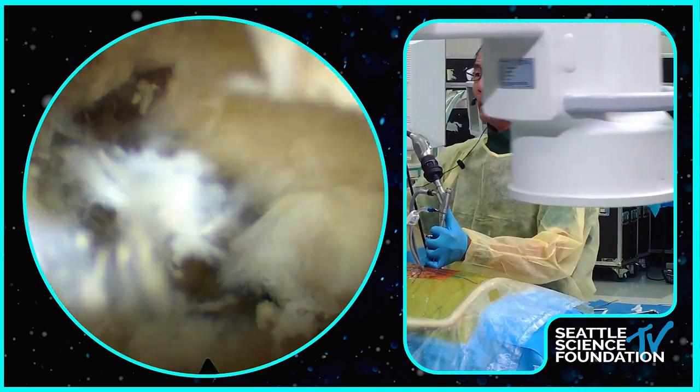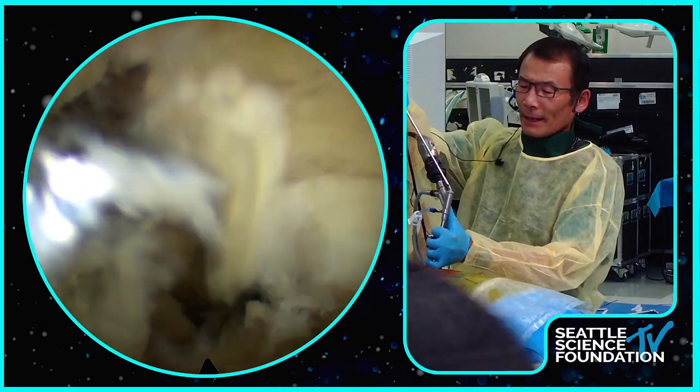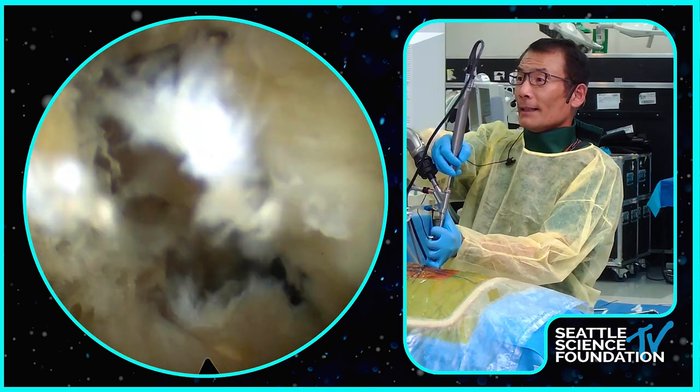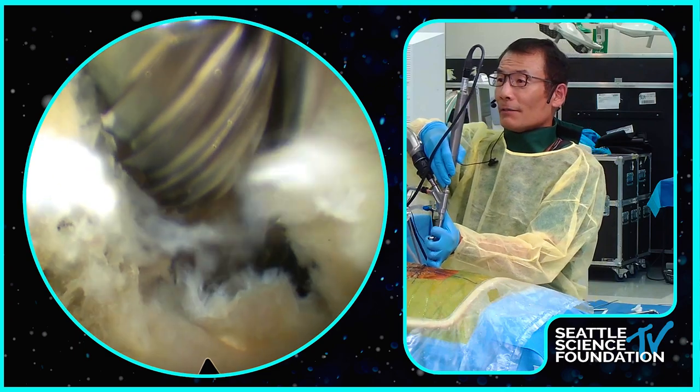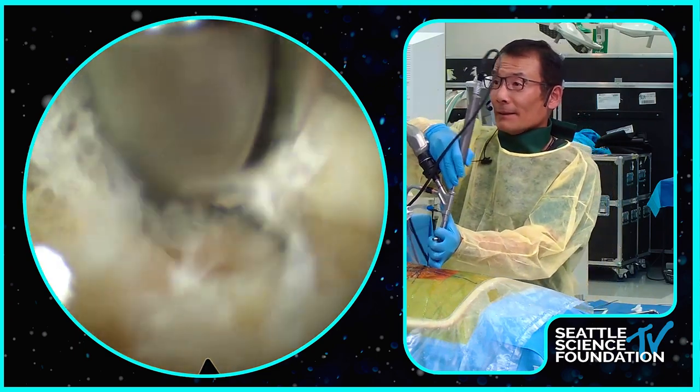Drill is ready. Okay, so now I turn my scope 90 degrees. I'm looking distally and trying to look laterally too. So see, my protective sleeve is against the traversing nerve. I'm working my way, drilling my way laterally.